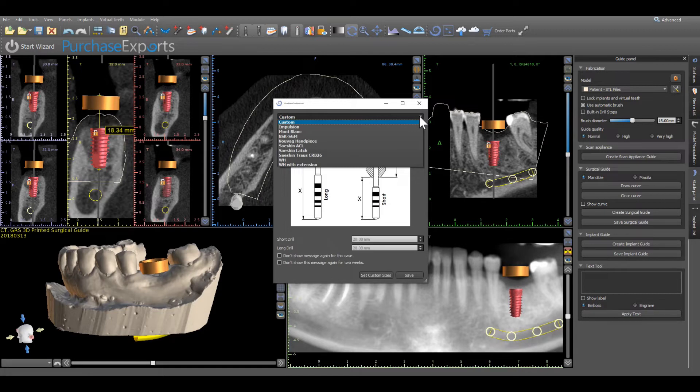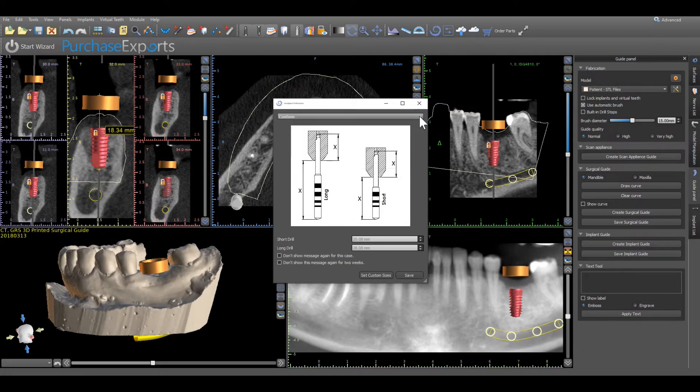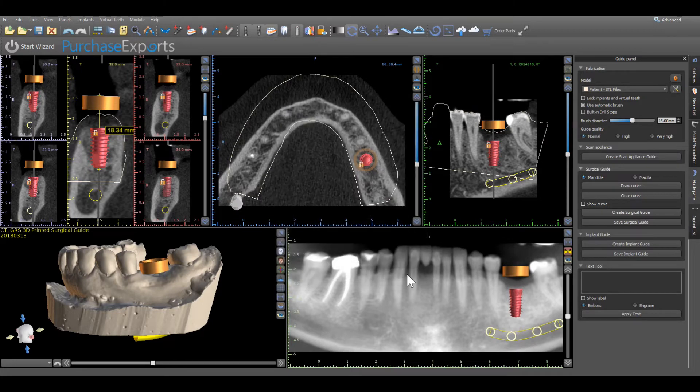If this is not a required element, keep the drop-down list on Custom and click Save. The guide fabrication process will automatically begin.